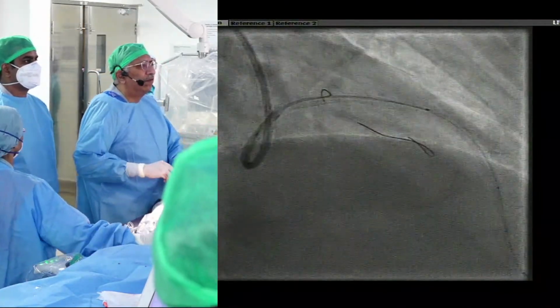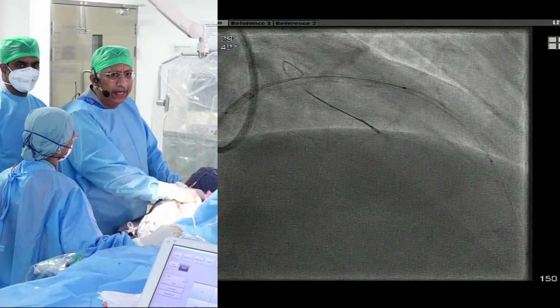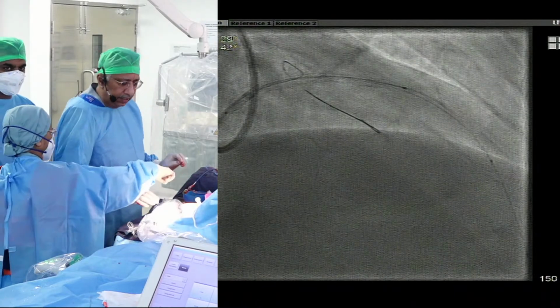Are we injecting 5? Because it seems we're not injecting 5. We are at 520. 620. Yeah, okay.